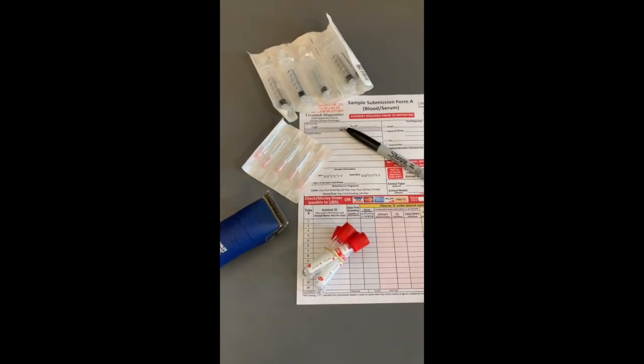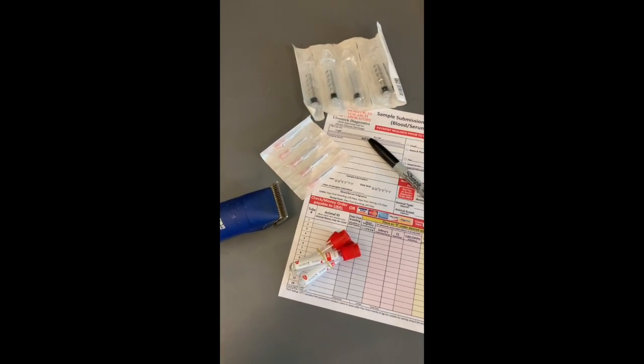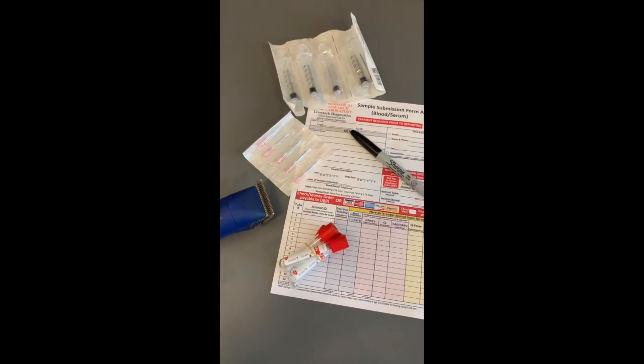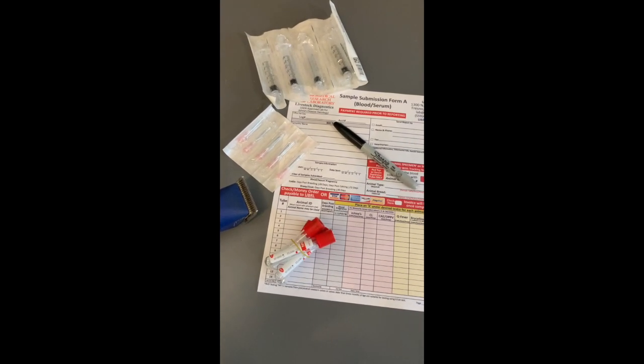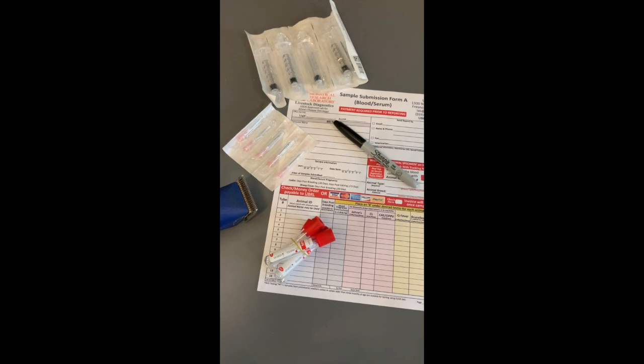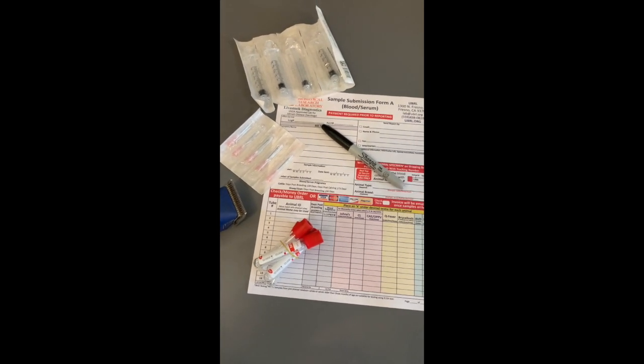Today we're getting ready to do some blood tests. You can use blood tests for checking pregnancy on a goat, and it's also good once a year to do a biosecurity scan on your goat to test for diseases like Johne's, CL, CAE, Q fever, and brucellosis.